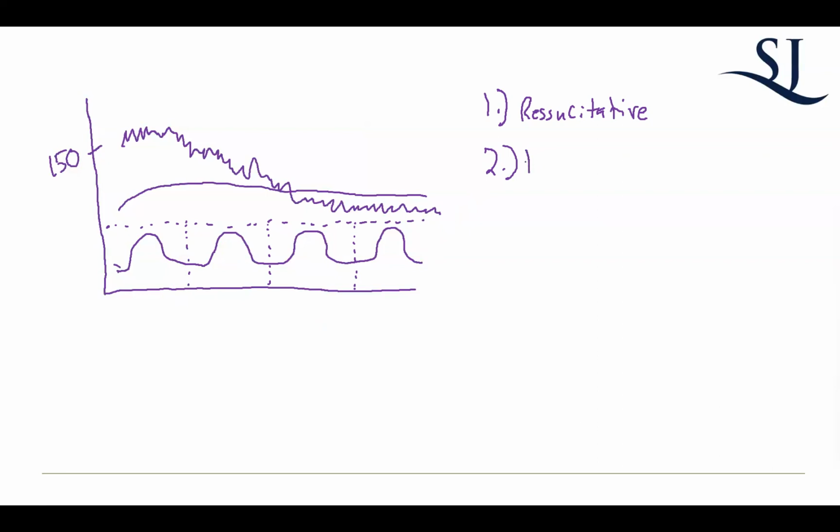So I told you that tachysystole is not a problem if baby is doing okay. But here, baby's starting to get stressed out because the contractions are too frequent and the fetus can't recover. Because what's happening is the uterus is contracting and that's cutting off the blood supply, at least that's the thought anyway, and that's causing baby to be stressed. You could appreciate that because there's still moderate variability, the fetal status is otherwise reassuring, right? It's like baby is doing okay, but just can't catch a breath. So what do we do in this situation? What do we administer?